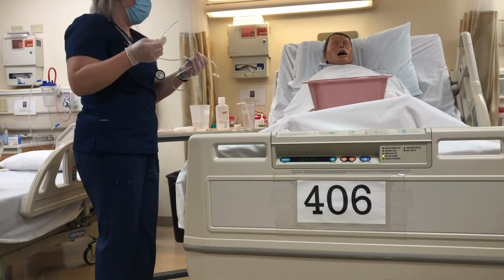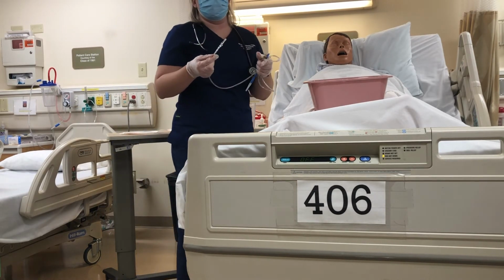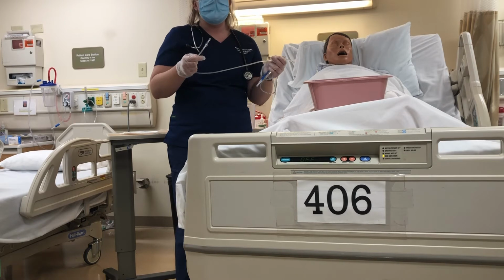Okay, so I'm going to put some lubricant on the end of this tip. I did notice when I assessed her nostrils that she has a bit of stuffiness on the right side, so I'm going to use her left naris to insert the NG.